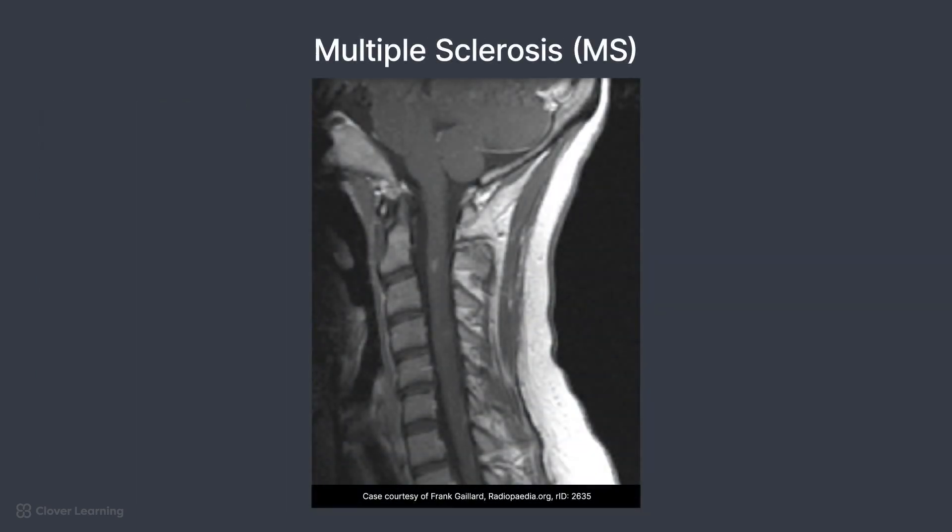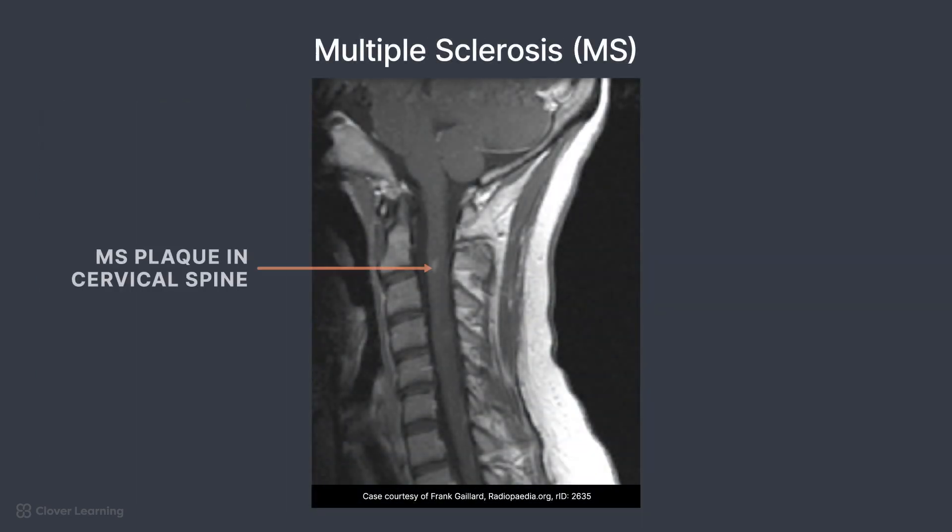If a patient has multiple sclerosis, often a brain scan is ordered, but MS plaques can also spread to the cervical and thoracic spine. For these patients, a sagittal FLAIR may be added to the protocol. On the FLAIR weighting, the lesions would appear as brighter plaques within the cord. This has been an overview of common pathologies associated with the spine.